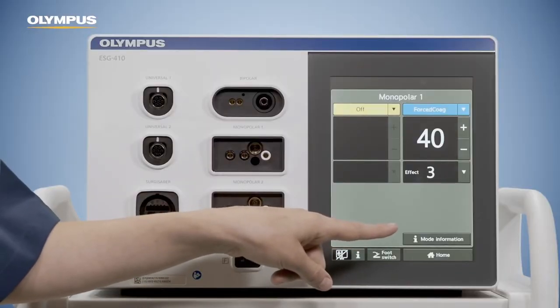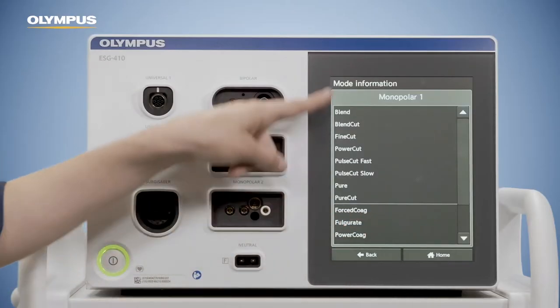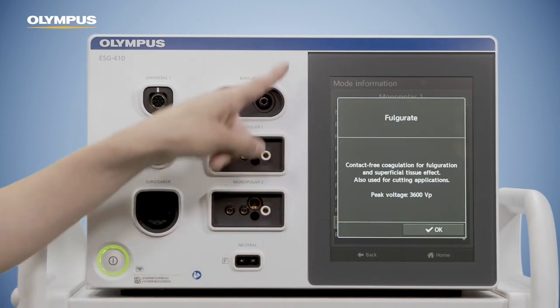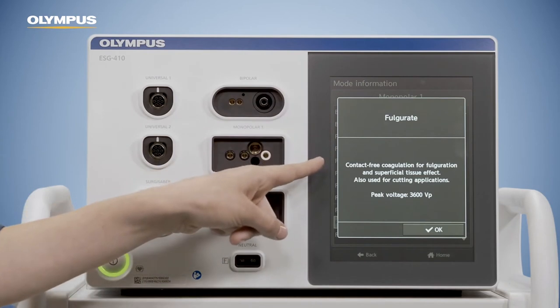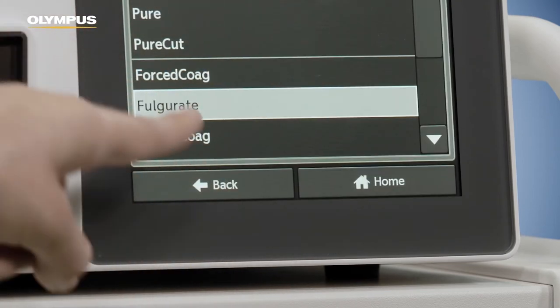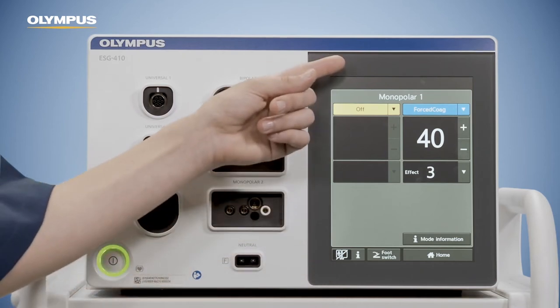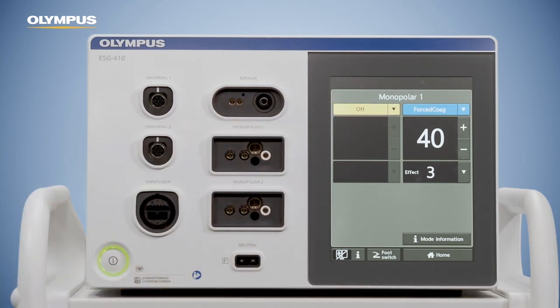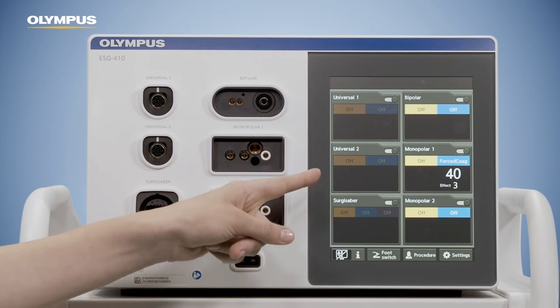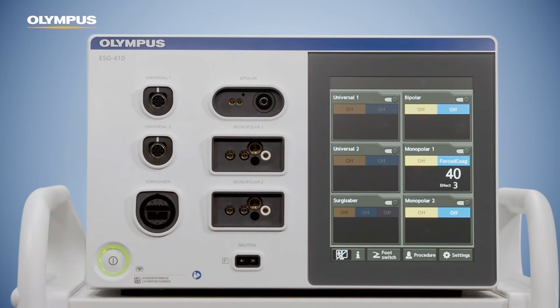Detailed mode information can be found in the mode information screen. Just click on the button at the bottom and select the mode you want to have more information about. A pop-up window appears which describes the mode. Confirm this window and go back to the set screen. Stay in the set screen when activating the instrument if you prefer the enlarged view. Pushing the home button leads you back to the home screen. The mode and settings you chose before are now displayed in the respective socket pane.